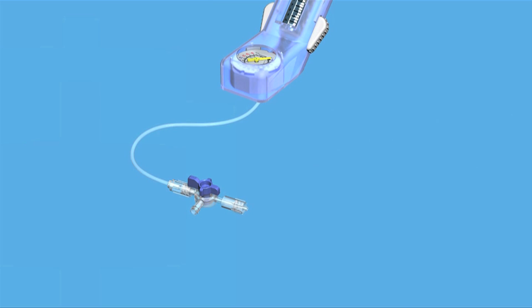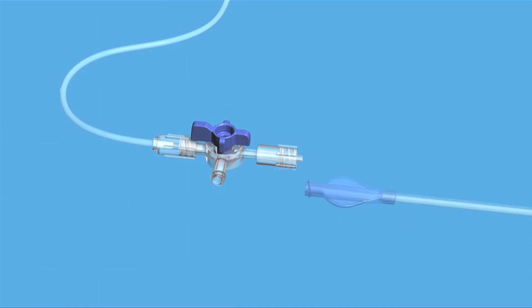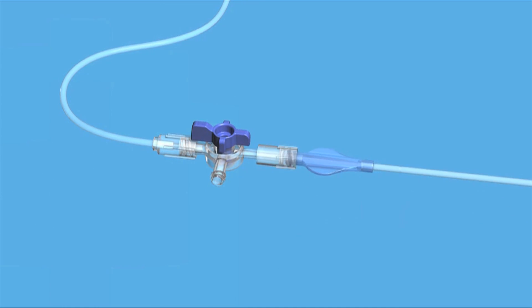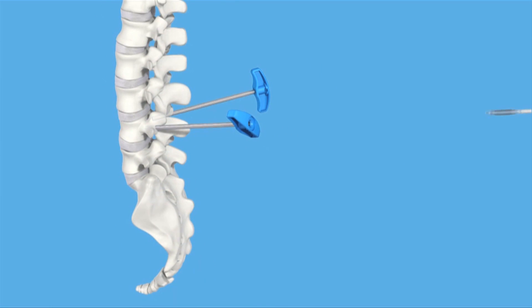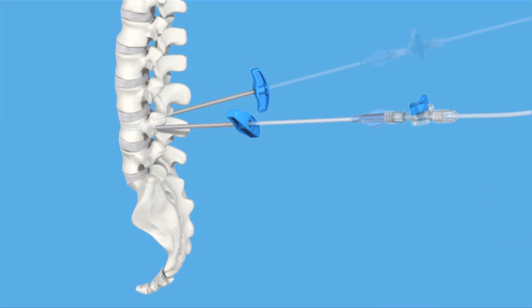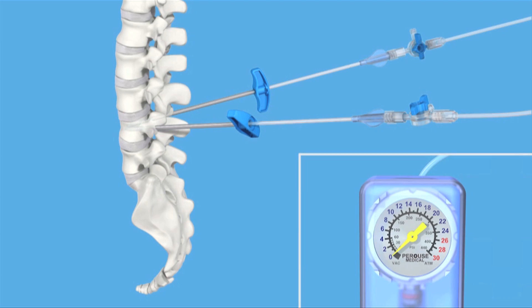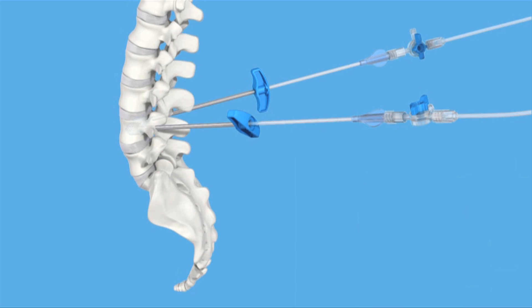The animation shows the function of the spinal application of stenting, which is well known from percutaneous transluminal coronary angioplasty. By inflation of the VBS balloon catheters, the stents are deployed while simultaneously restoring the vertebral body height and reducing spinal kyphosis. The balloons are then deflated and removed.